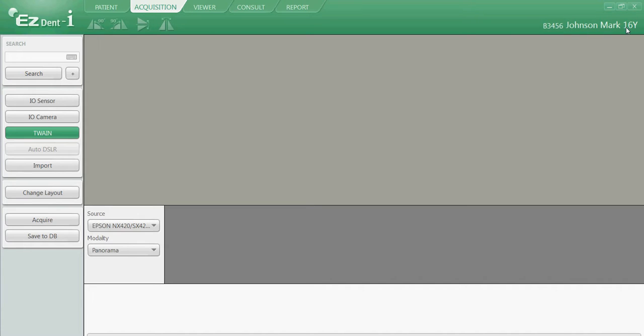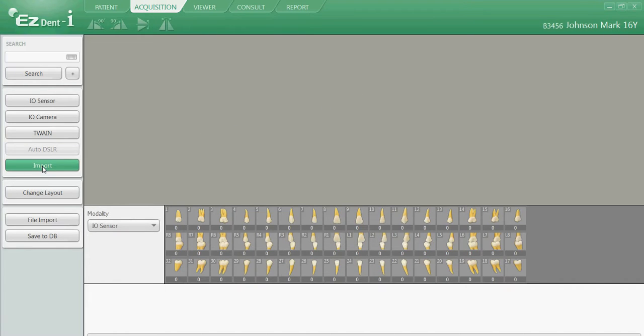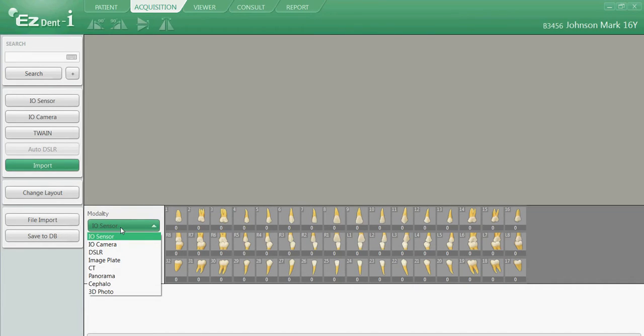We'll then navigate our mouse to the opposite side of the window and choose Import. We'll then navigate down to our modality and left click on our option for intraoral camera.